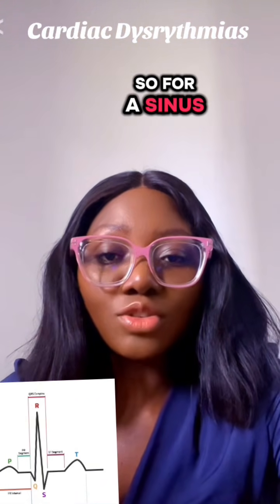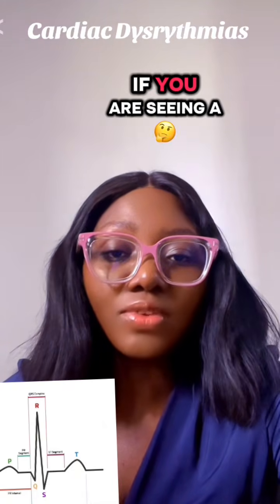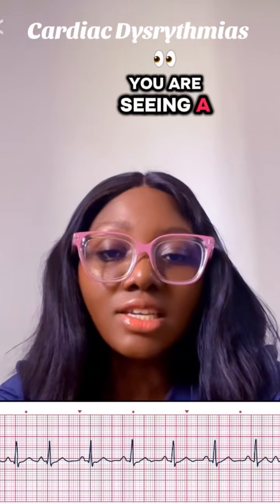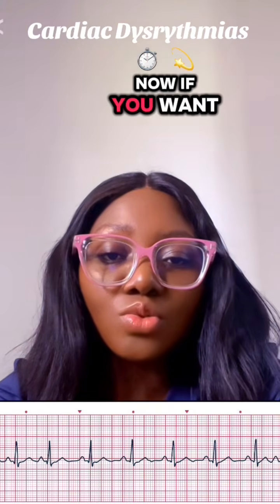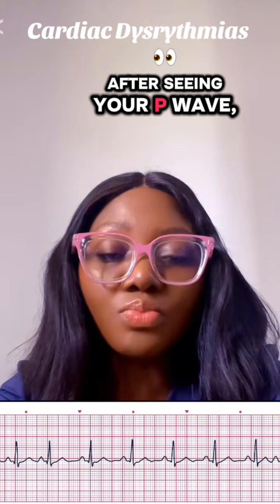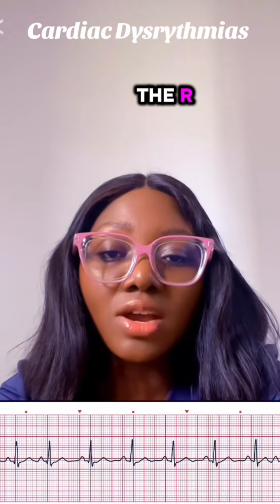So for a sinus rhythm, it means that when you take an EKG strip, if you are seeing a sinus rhythm, it means you are seeing a P wave, you are seeing a T wave, you're also seeing a QRS complex, okay? Now, if you want to determine if it is a sinus rhythm or not, after seeing your P wave, your QRS complex, and your T wave, count the RR intervals.